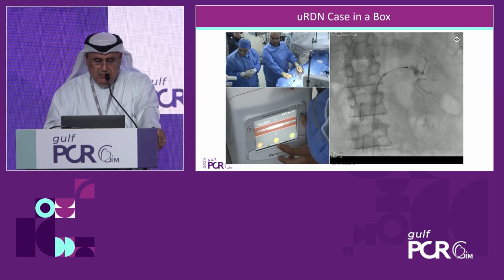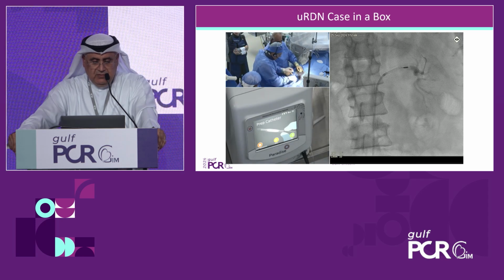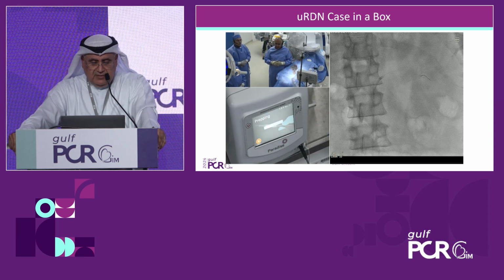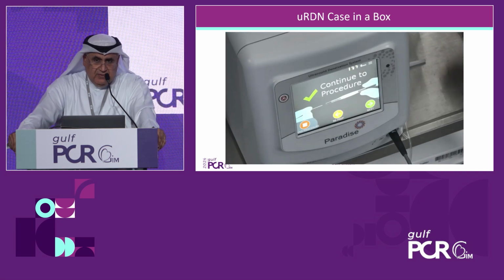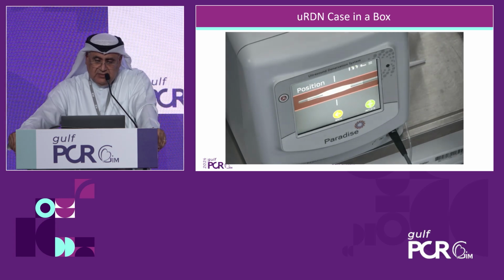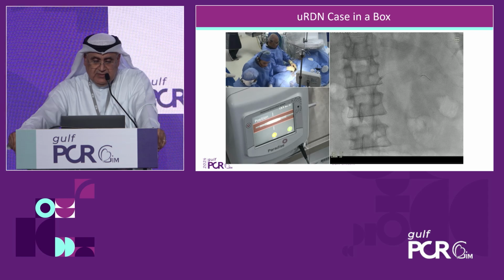So then we can go step by step, as you see on the left side. Preparing the catheter with the cooling. This is pre-cooling, will start now. All we need to do is to connect there. 1 minute and 30 seconds. And the size has been given here. 5.9 for this vessel was measured, but we have to check here by giving contrast after inflating the balloon, injecting contrast to see whether we are really blocking the contrast flow, so we have a good wall position from the balloon. We will see now.